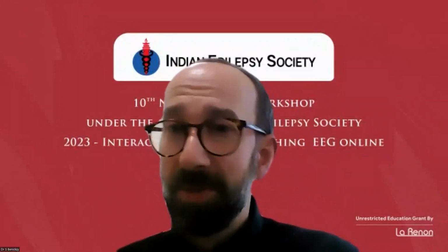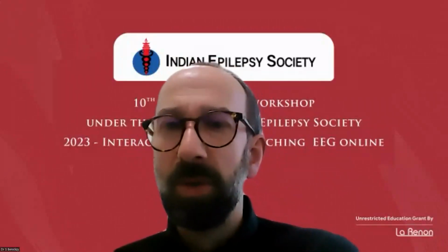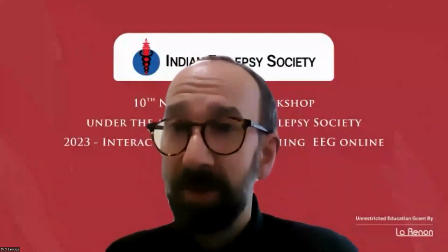Right. This is a very, very good question, because when we developed these criteria, we did not spell this out. So I fully agree, we didn't specify this sufficiently. Now I can tell you that a working group has developed expert-based consensus criteria, which we will submit very soon. Our experience is that the improvement of the background activity is rarely useful as a criterion in the intensive care unit. So we kept it for the non-critically ill patients, because you still need criteria for status epilepticus outside the intensive care unit too.